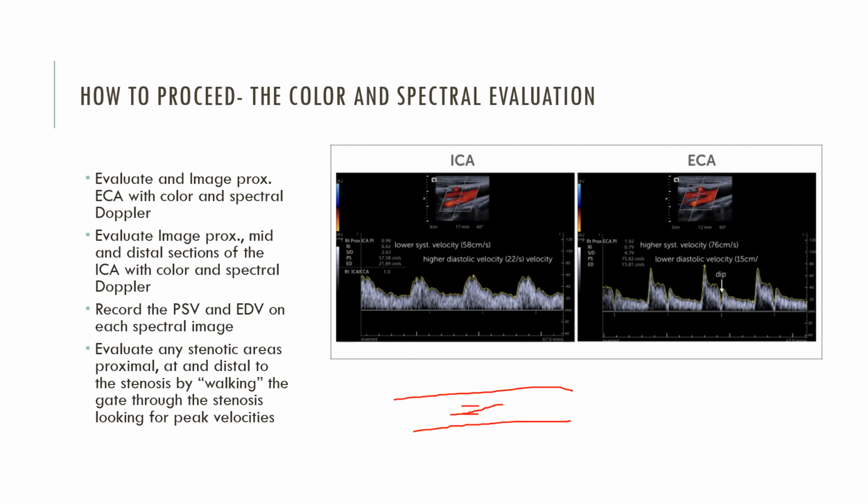Now, sometimes changing the angulation of your color box will help change those angles as well. So don't be afraid to change those to see if it makes getting those appropriate angles a little bit easier.